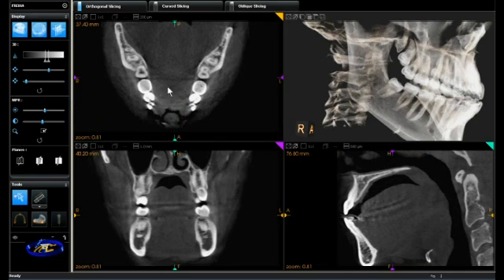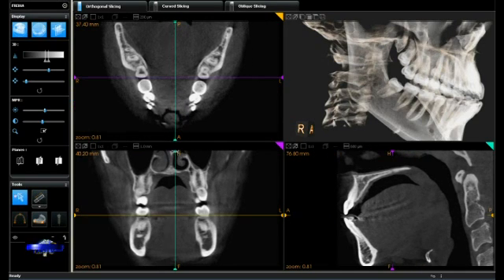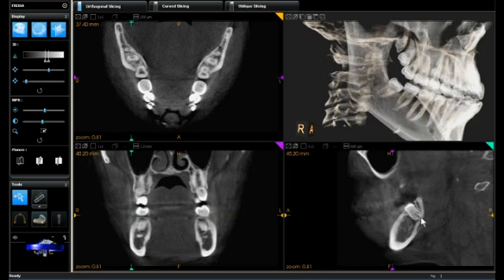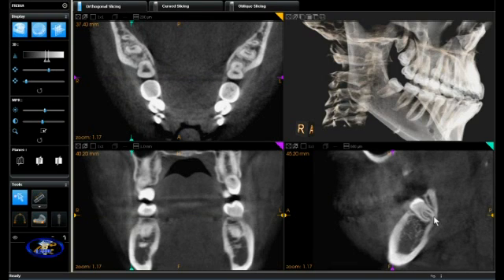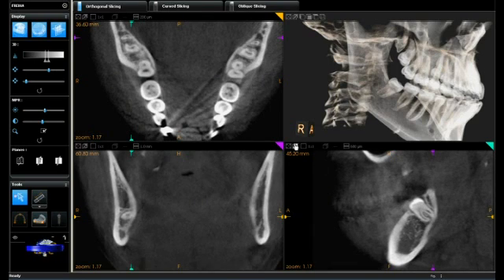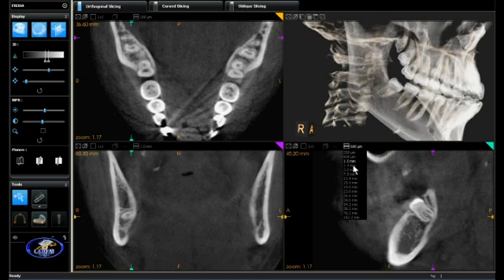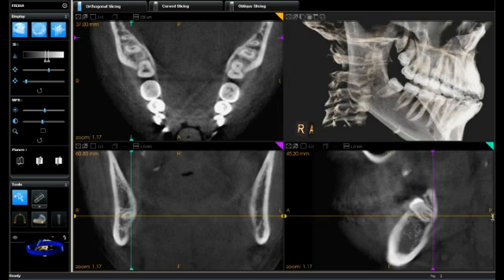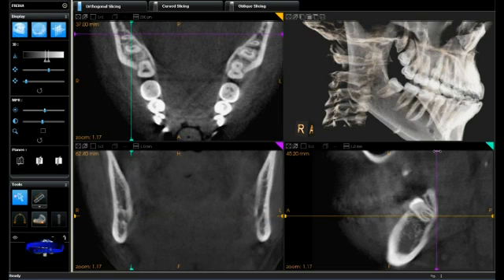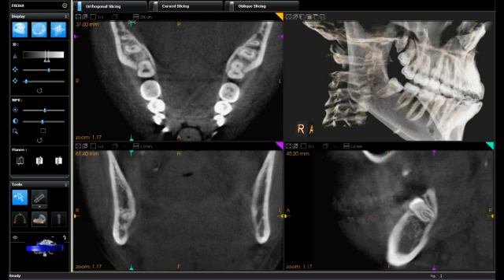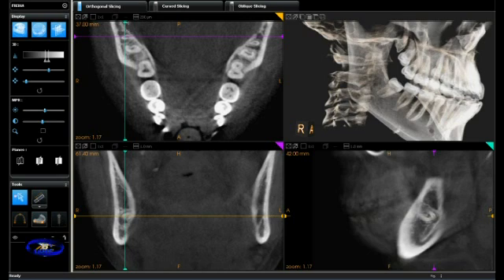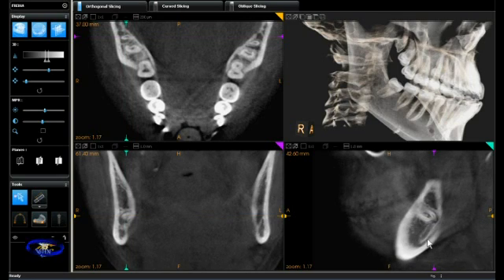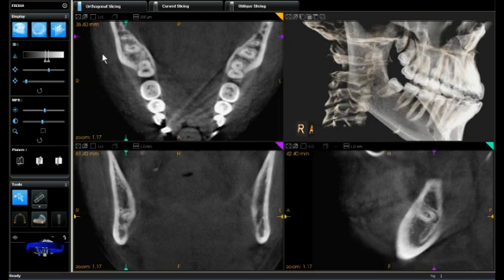The lower left panel is the coronal view and the lower right panel is the sagittal view. All of these views are orthogonal — at right angles to each other — which allows us to visualize the intimate relationship of the third molar to the nerve canal in all three dimensions. On the lower right we can clearly demonstrate some impingement of the root on the nerve canal, so caution must be taken if extraction is treatment planned. There is definitely some close proximity visible on the coronal and axial views as well.